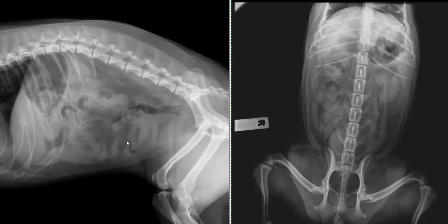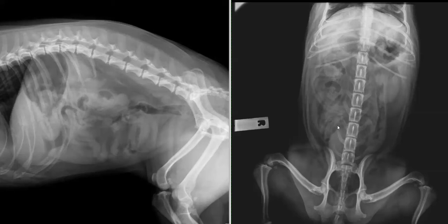The next organ I evaluate is the urinary bladder. The legs have to be pulled off the abdomen enough for you to see the bladder, remembering its variable size according to whether the animal has urinated or not. Here's the outline of the urinary bladder on the ventrodorsal projection. The radiographs we're looking at are for a female dog — remember that in the male, you'll have the os penis superimposed over this study. The prostate gland in males lives at the caudal aspect of the neck of the bladder, not present in this animal, which is a female.